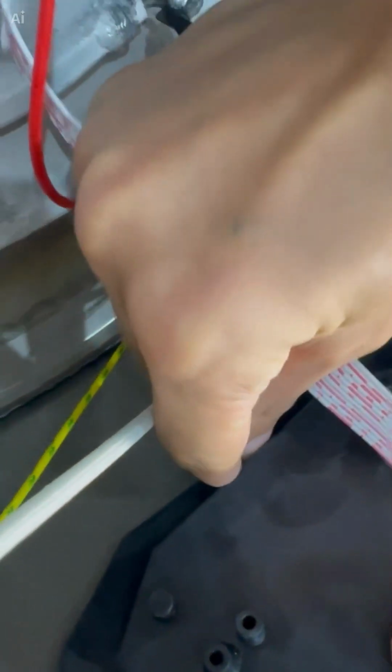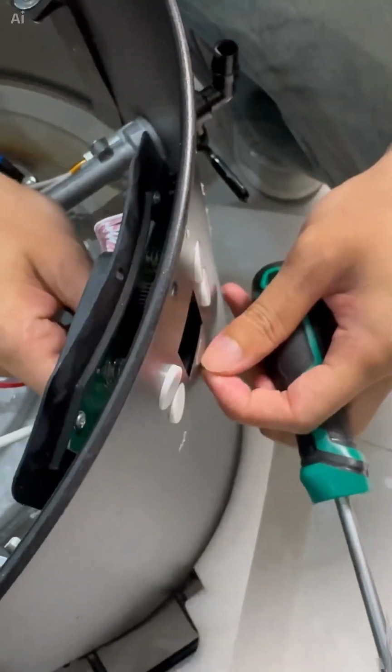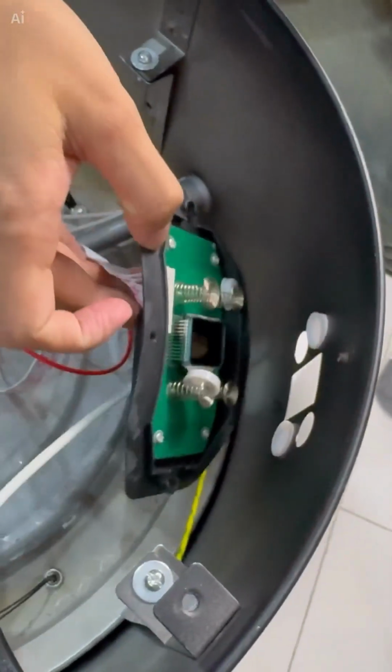Okay, let's also hold this nut by hand. Then come to the front to remove this screw. Be careful with this too. Make sure to place this screw properly. Okay, now this is already removed.